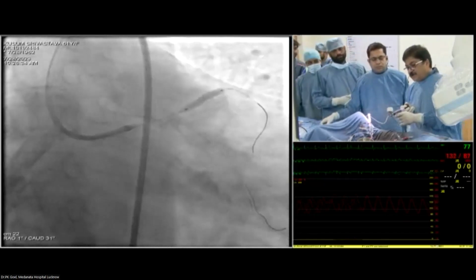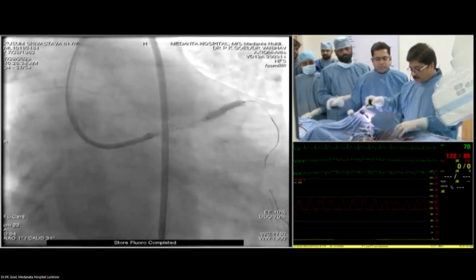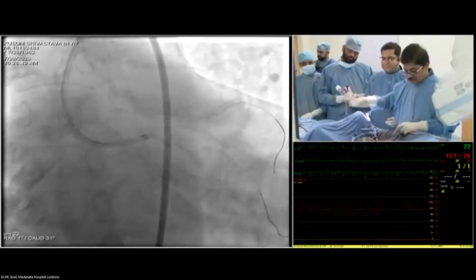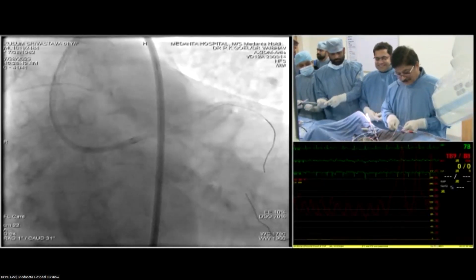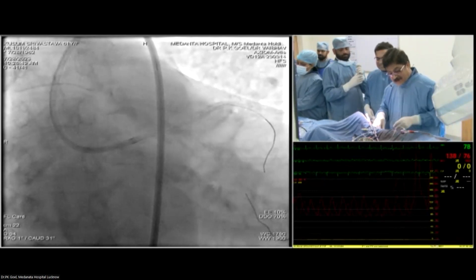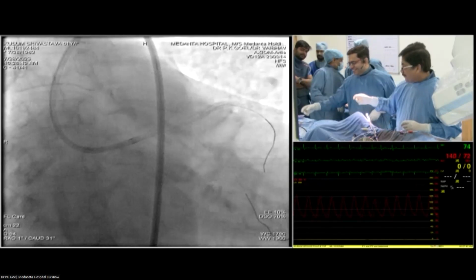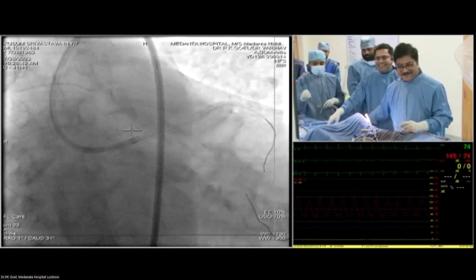If you ask people in the audience to raise their hands, how many would want a crossover stent in this, and how many would want a two stent? Can we have a voting? Provisional stent, raise your hands. How many two stent strategies? Okay, provisional stent wins by about maybe 70 to 30 percent. Out of those 70, 40 might be theoreticians. You see, practice is stronger. So you got equal percentage, 30 and 40 practitioners. Very good.